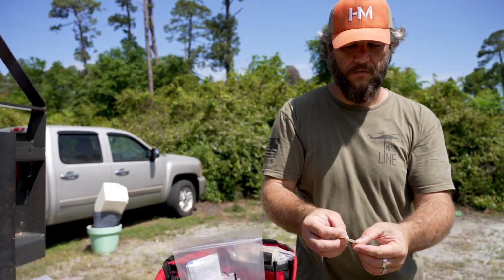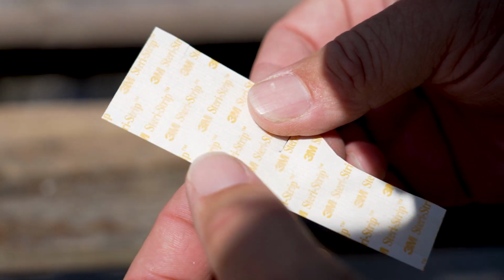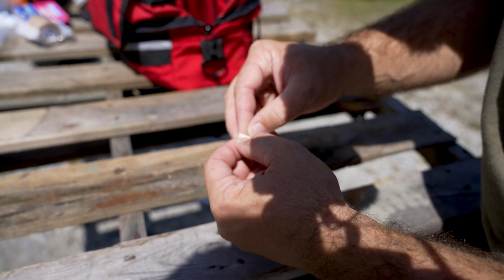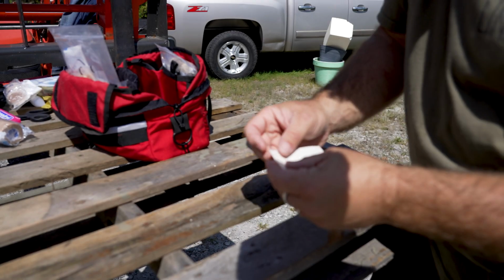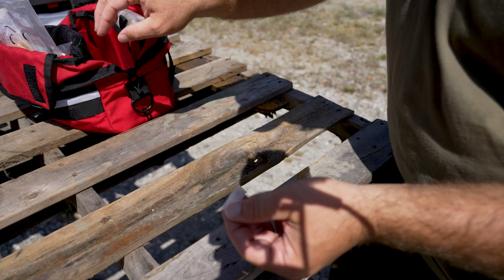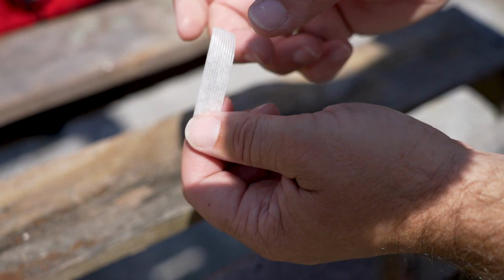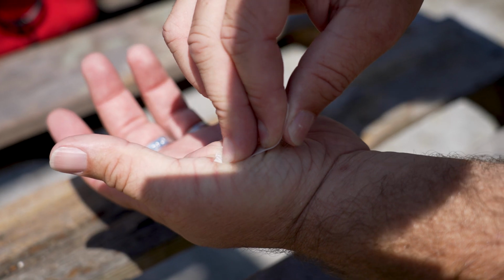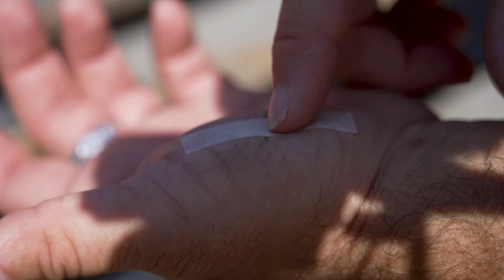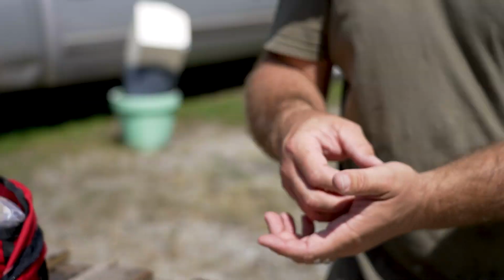If you want to come over here, and let's make sure we can get this really good. This is how long they are. But I cut these in half. This one's not going to be Steri anymore. So you can see right there. So let's say you had a cut right here on your thumb. Take that there. Pull that across. And for something that you would maybe need minor stitches for, you could use this.